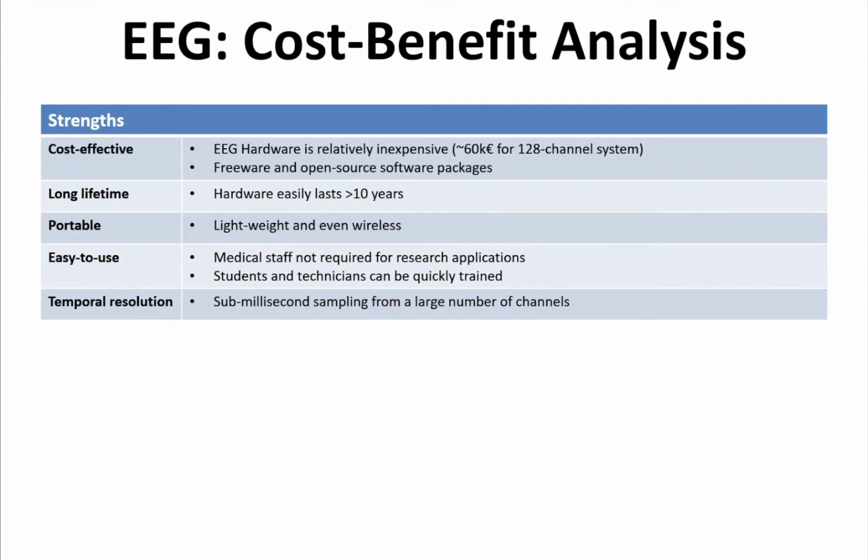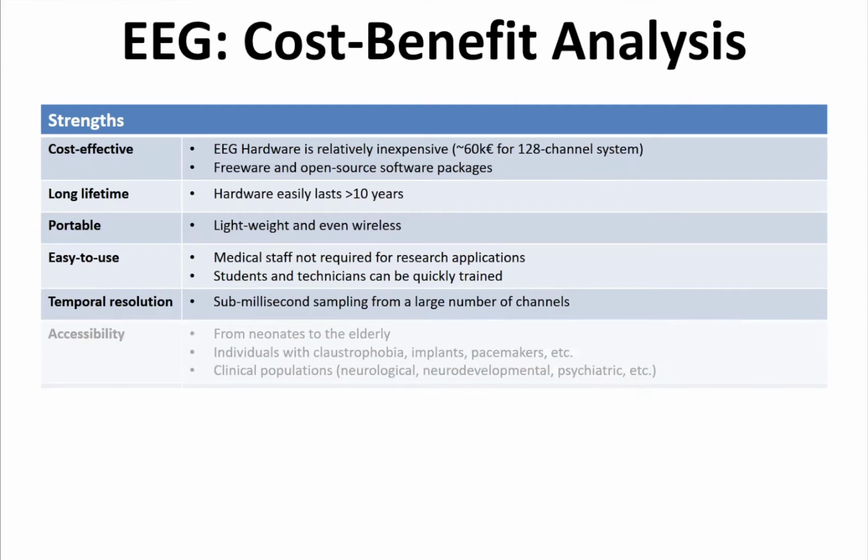The temporal resolution, of course, is on par with neural activity, that is sub-millisecond, and you can record simultaneously from a large number of channels. EEG is accessible. You can record from neonates to elderly, people with claustrophobia, implants, pacemakers, clinical populations, you name it, really. It's hard to imagine a population that we can't really access with EEG.